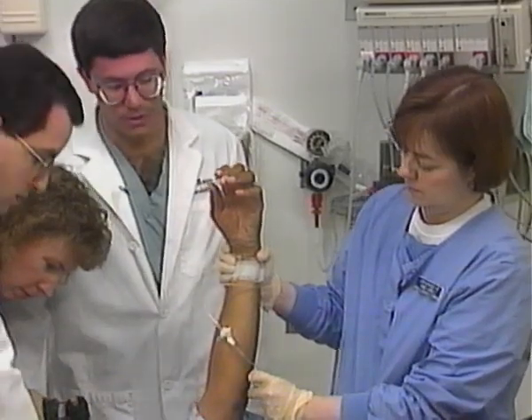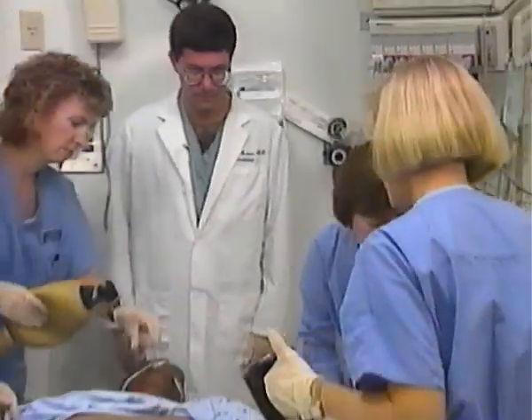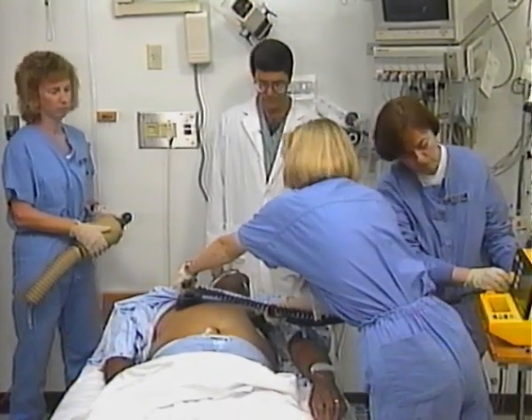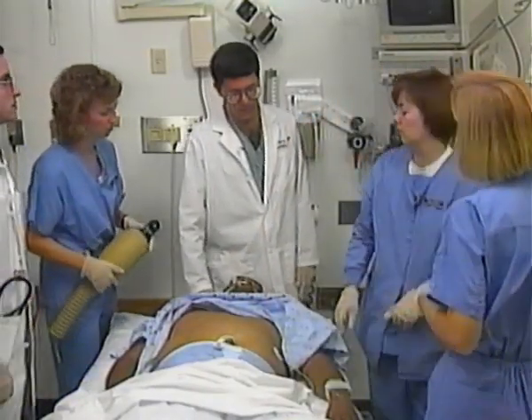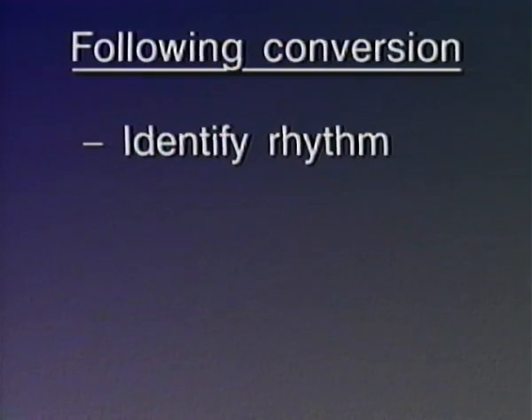Let's go ahead and shock him again with 360. Charge to 360. Charged. 1, I'm clear. 2, you're clear. 3, everybody's clear. Shocking now. Okay, I have a pulse. The patient converted to a normal sinus rhythm following the last shock.